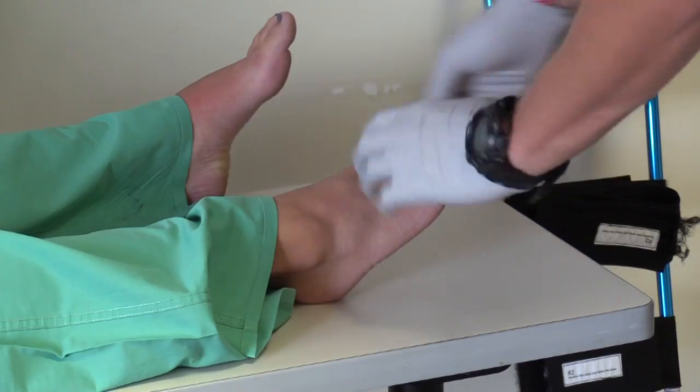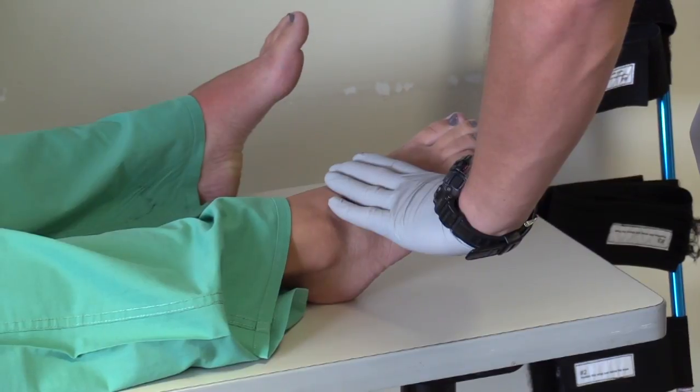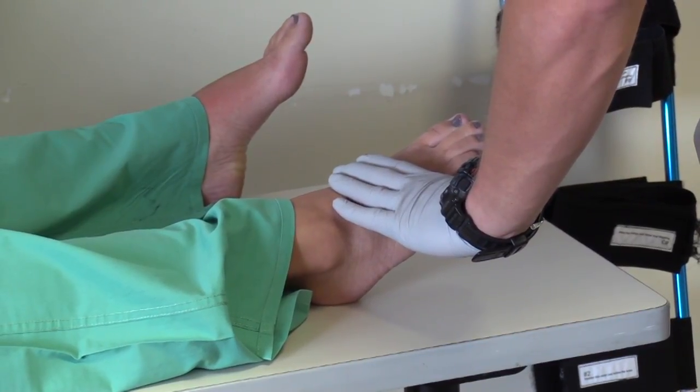Then, I need to assess for the signs of a closed mid-shaft femur fracture with no hip or pelvis involvement. Then, I will assess the pulse, motor function, and sensation in the distal injured extremity.